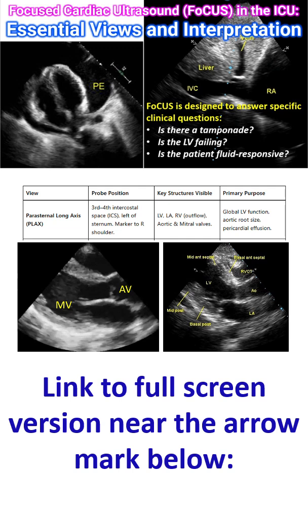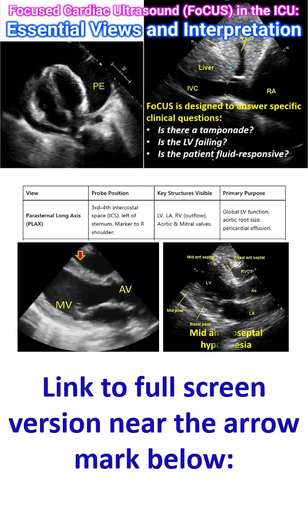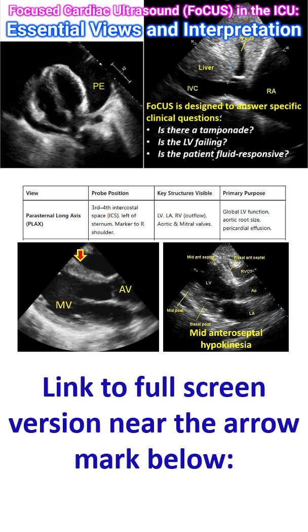This view can assess global and regional left ventricular function, aortic size, and pericardial effusion. This echo clip shows hypokinesia of the mid-anteroseptal region. The segments seen in this region have been marked mid-anteroseptal, basal anteroseptal, basal posterior, and mid-posterior.